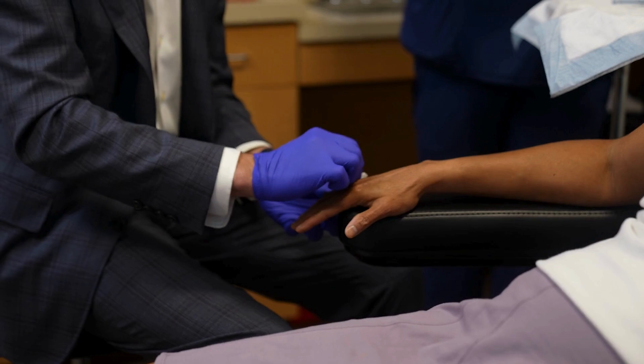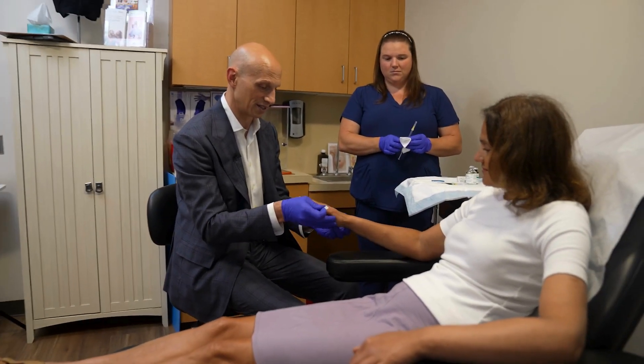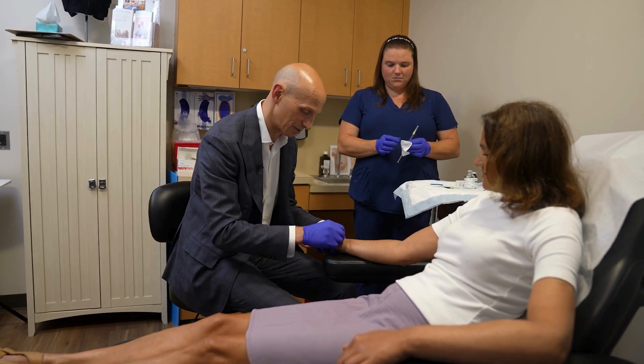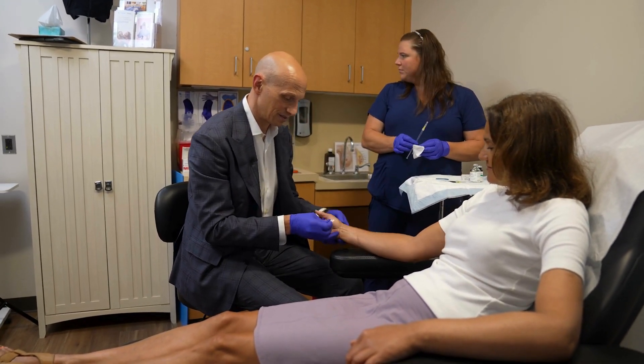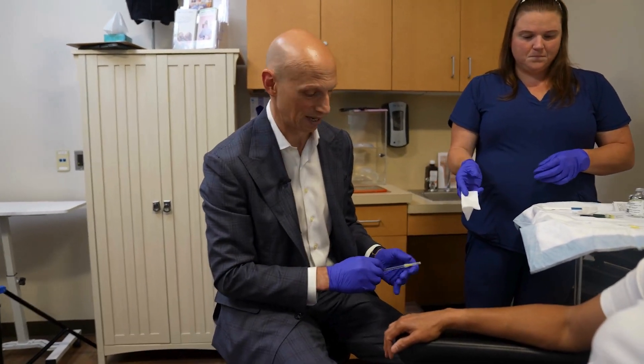Instead of taking the patient to the operating room and then seeing once they're under anesthesia — just having to flip your hand — we can figure out if they'd be a good candidate before going to the operating room.